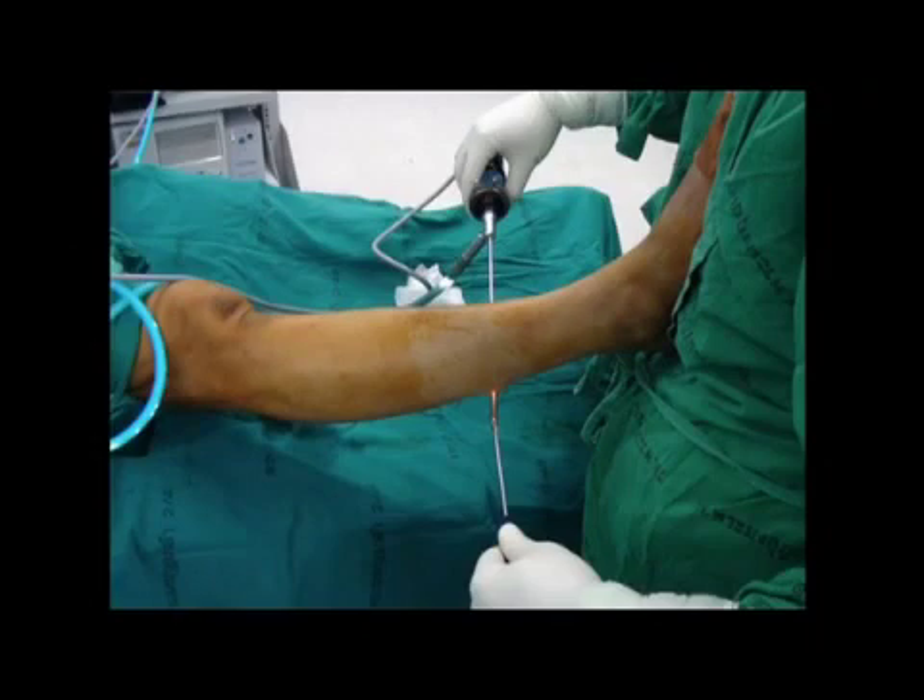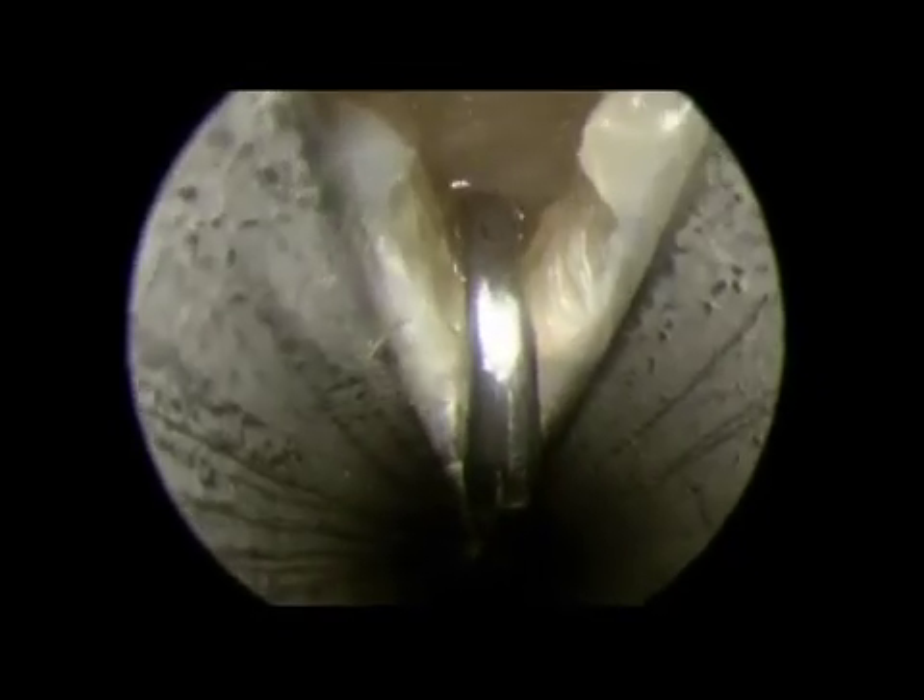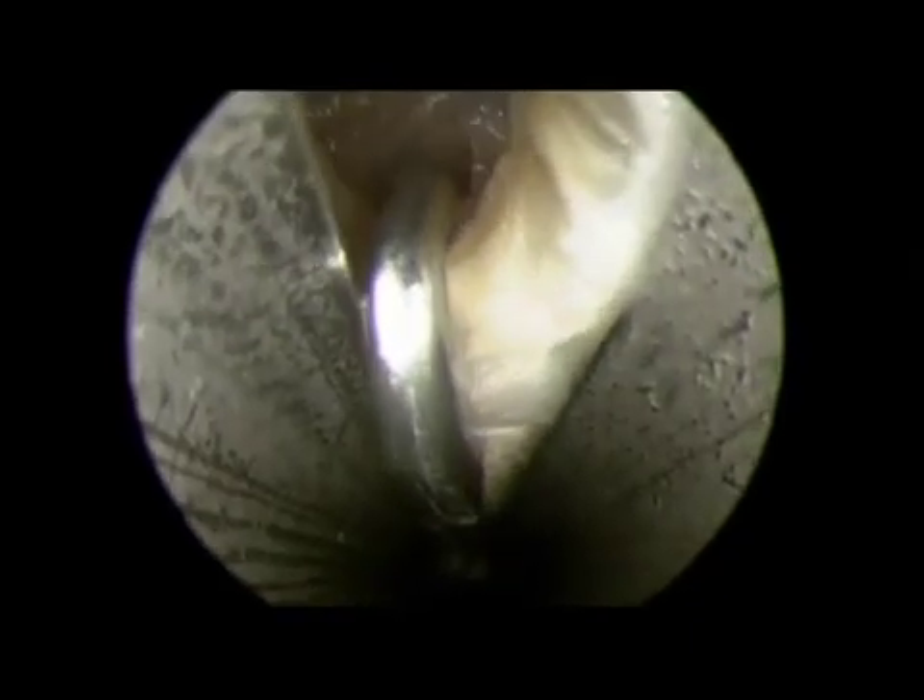For cutting the fascia, a retrograde knife is introduced from the lateral portal under endoscopic control. The knife is hooked from the medial side of the gastrocnemius fascia and the cut begins from the medial side. The process of the cut should be gentle and smooth. The fascia is cut completely from medial to midline and all the way to lateral.